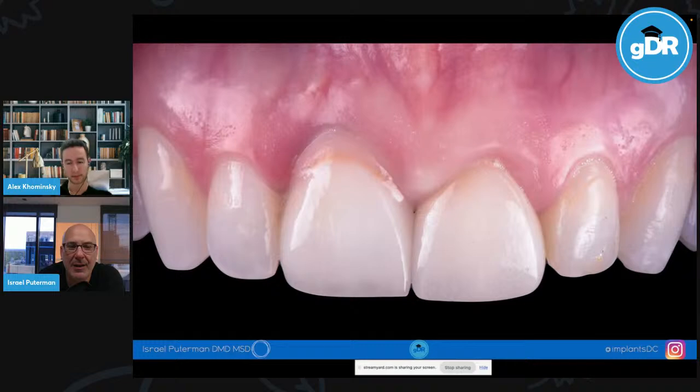And I'm like, eyes bulging out of my head. I'm the type of guy, I wear my heart on my sleeve. I'm not a good poker player. And like, okay, well, the incisal edge is really nice. I like that. Although it could be a little more rounded. I like the interproximal papillae. I love those papillae. And so I say, okay, well, let me give this dentist a call.